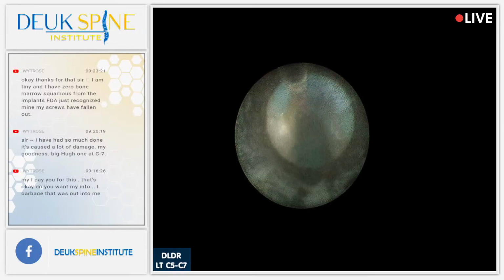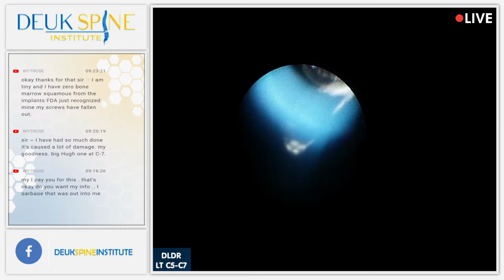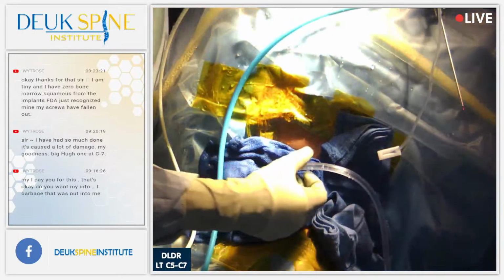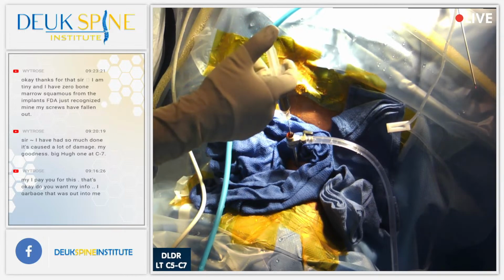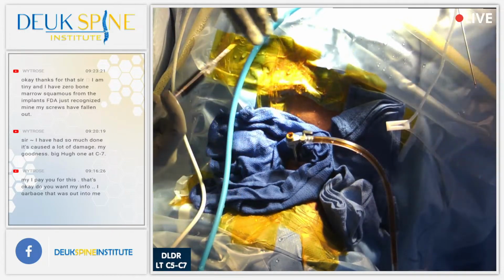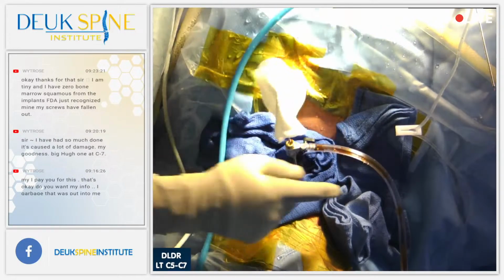All right, we're pretty much done here. I don't see any more herniations. We're done. Woo, my hand is freezing. You guys did an awesome job. How do we get such nice cold irrigation? Cold irrigation is important for the laser. All right, that's betadine. What is betadine? It's an antiseptic. We use it to... how come my suction is off?